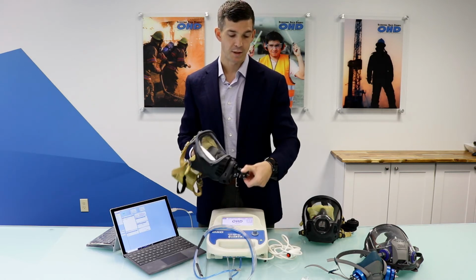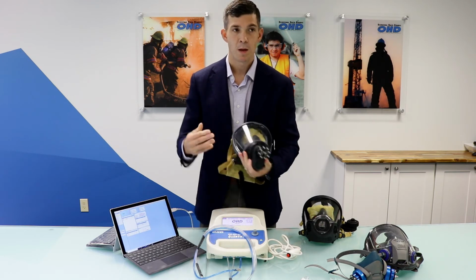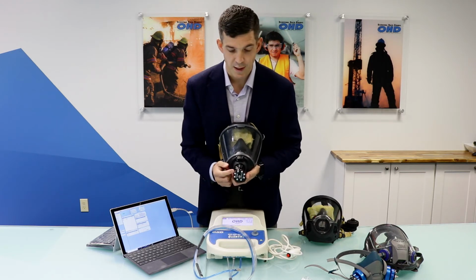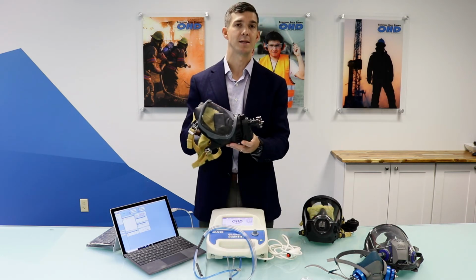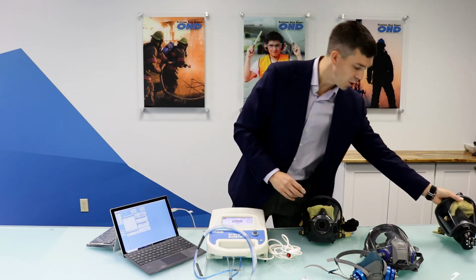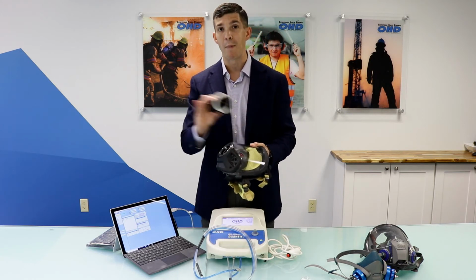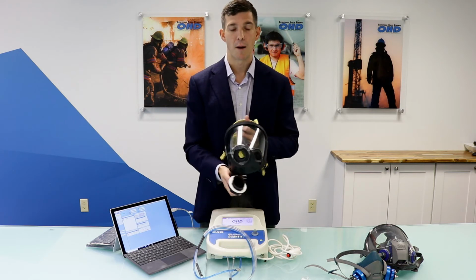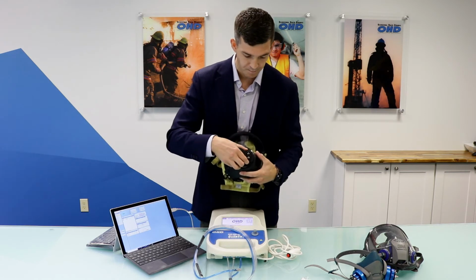And what we'll do is we'll thread this adapter into the front of our adapter piece here. Same thing as you probably already guessed, the two clear tubes will go to the two ports and the blue tube would go to the single port there. So it just converts the mask to allow us to put our adapter to it there. The last thing you need to know is other masks, we have individual connections. So what we do is we bypass a converter, and like the new Scott Vision C5 mask, we'll actually connect it straight up to the front of the face piece.